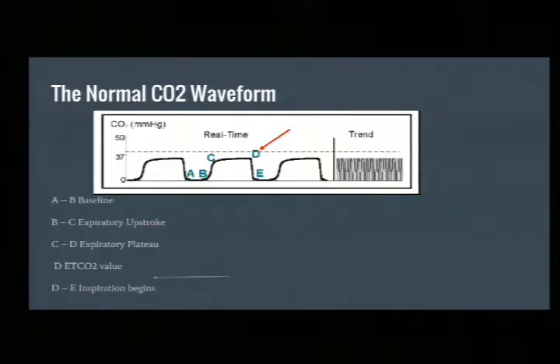Looking at the different phases, kind of what I went through, A is your baseline, A to B, that kind of flat. That's your inhalation and sitting there before you exhale. This is kind of that fast beginning to exhalation, and then D is maximum expiratory of all your gases right before you take your next inspiration. So, again, looking at that, that's what you're looking for, is where your peak is.